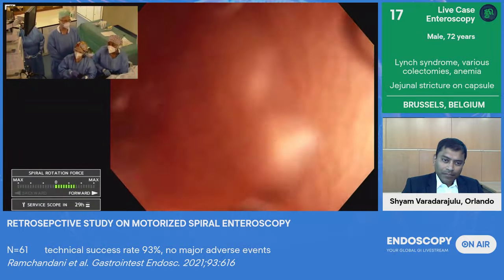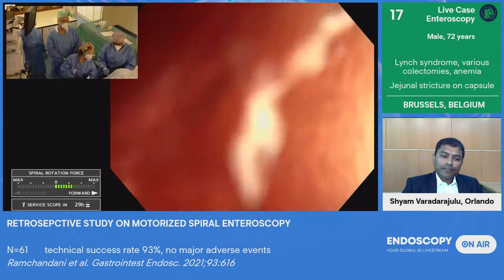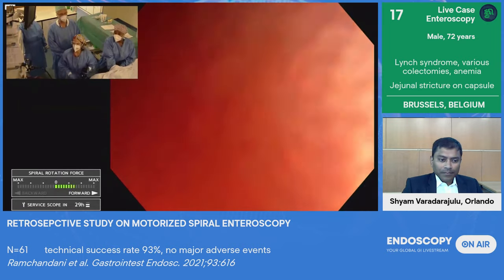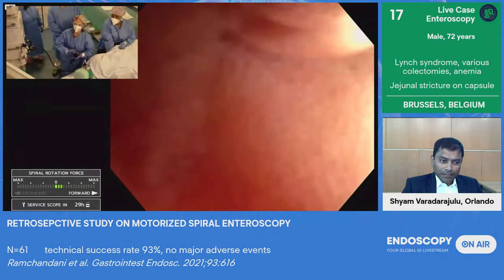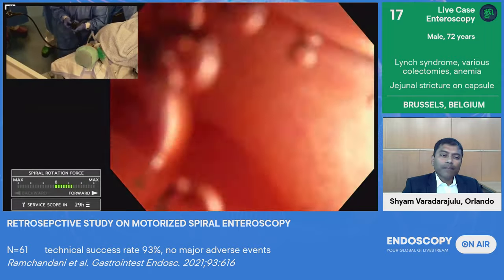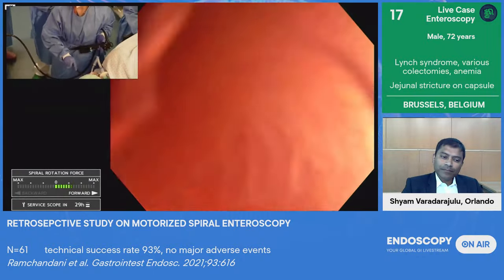The two multicentric studies which have been published so far have shown the feasibility, the fact that it works very well. The fact also that even in the hands of people who are not really the highest specialists in enteroscopy, we can achieve a complete enteroscopy up to the cecum in a significant percentage of cases through the antegrade approach. And when we combine both, we can achieve a complete enteroscopy in more than two thirds of the patients.